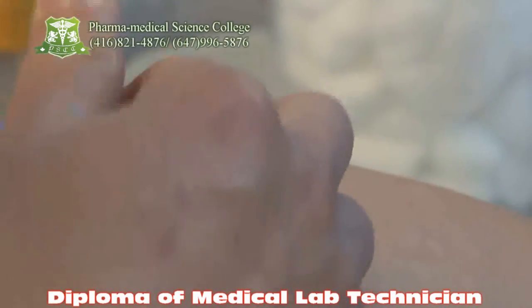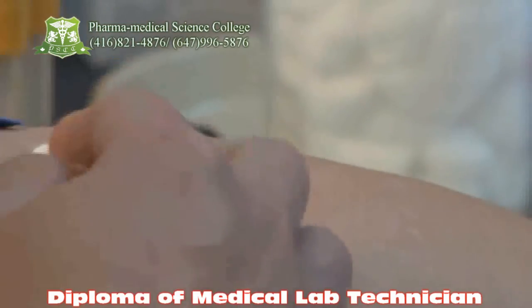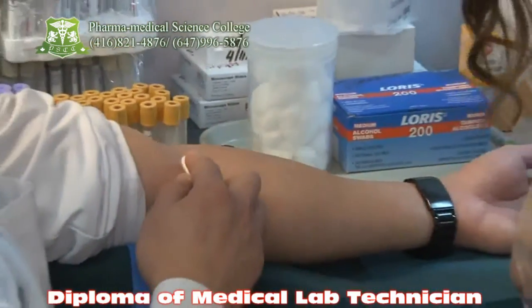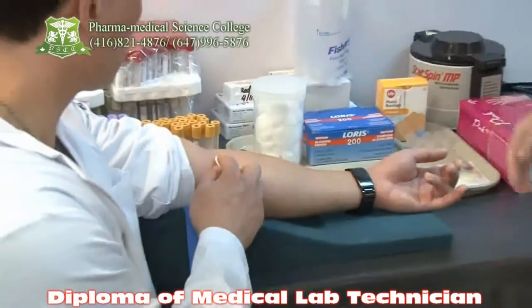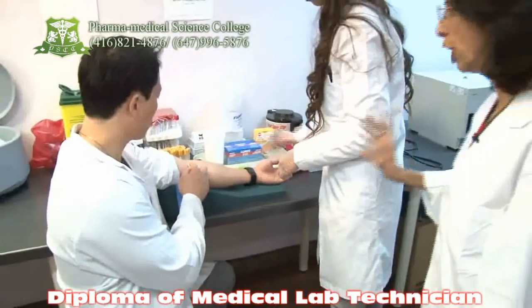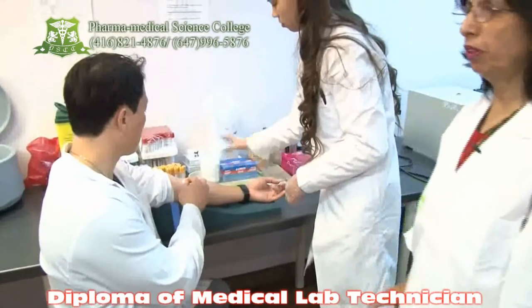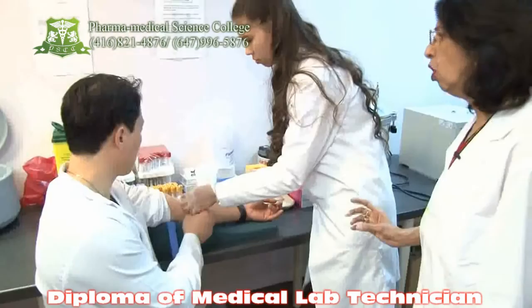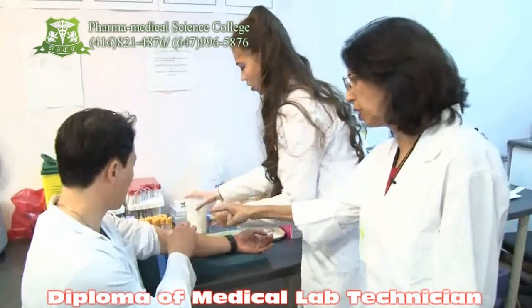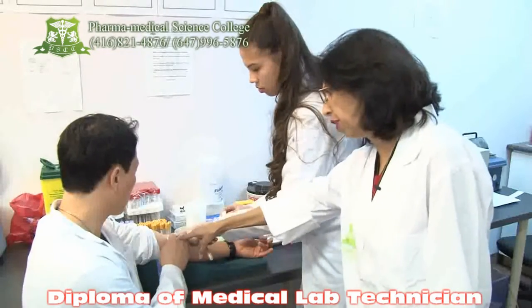Now the needle and the holder have to be locked and discarded in the sharps container. The act of phlebotomy is done. But right now she has to check the site of the phlebotomy. Is it still bleeding or is it fine? If it is fine, you have to ask the patient to keep pressing it for five minutes.